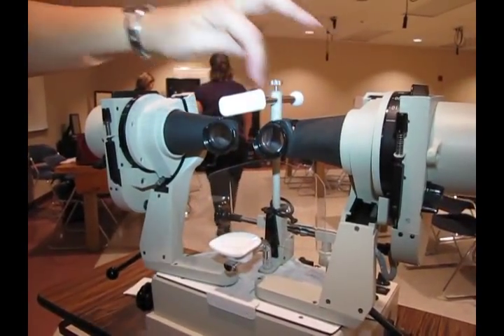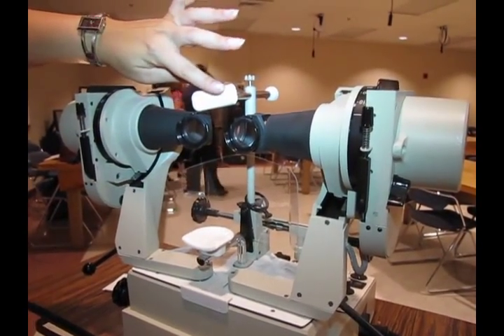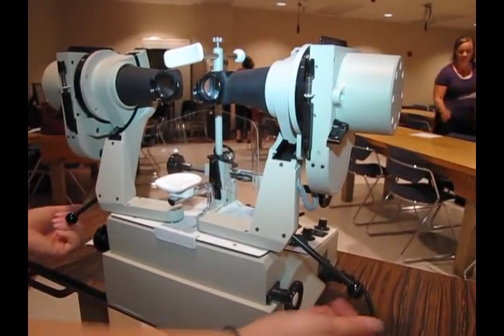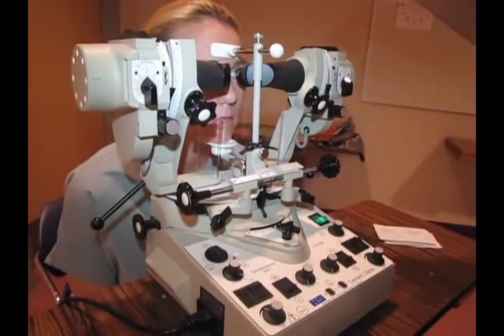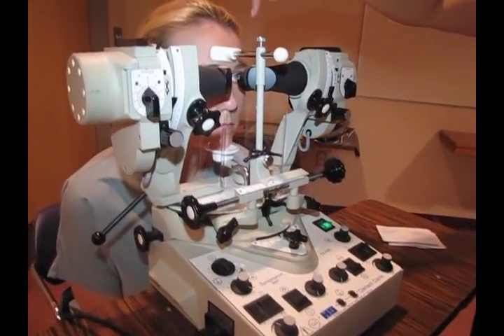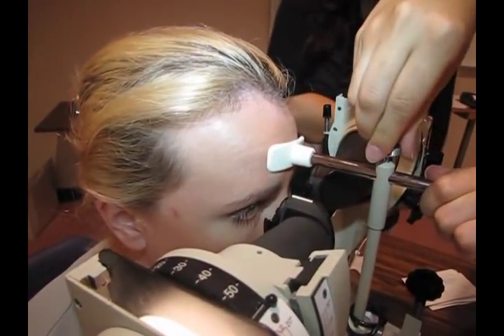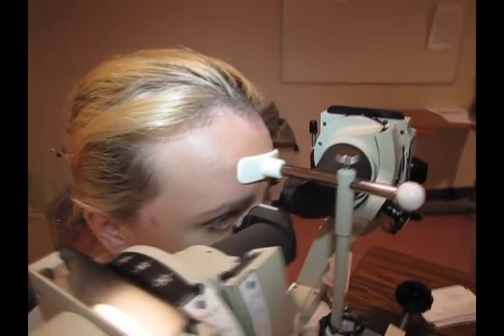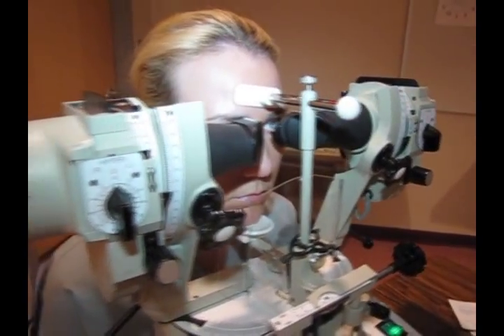This is where the patient's looking through. So as you remember, this is the chin rest, so this is patient side. That's the forehead rest. And here's the on the patient side where they would be moving it to get the subjective angle. So you want to make sure that you can still see her eyes above. So this is what that will adjust. So I'm going to bring her just a little bit closer. And then you want to make sure that the eyes are illuminated up and down equally, so that'll be the chin rest. And now I can still see her eyes.